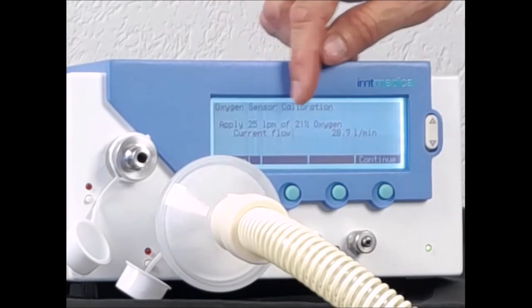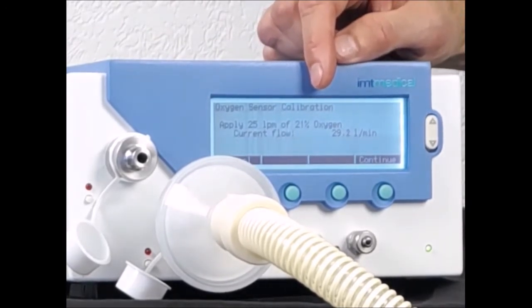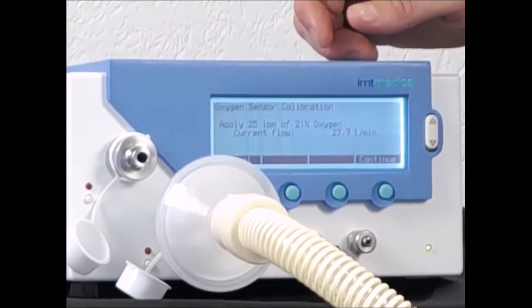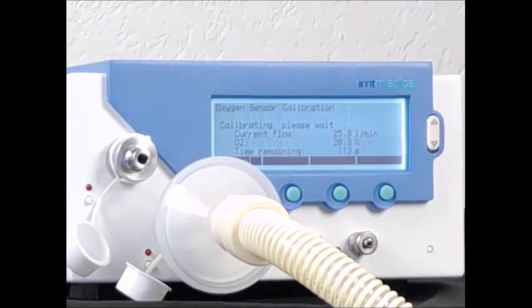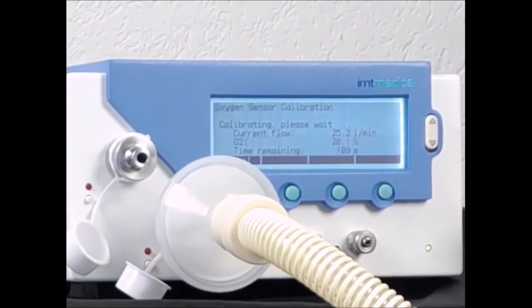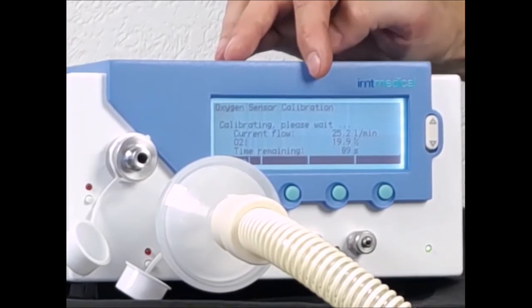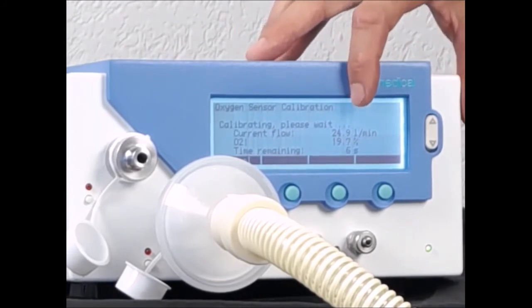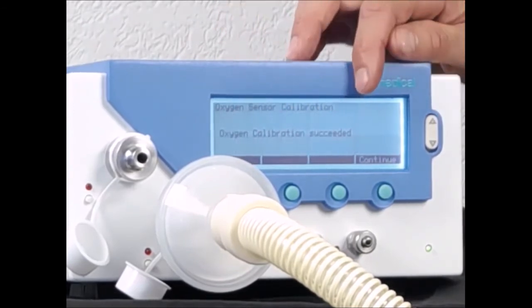It now tells me to apply 25 liters per minute of air. I use the service controller of my ventilator to blow air through — I have 29 liters, so I fine-tune that to about 25. When I am happy, I start the 21% point of oxygen calibration. This process, which takes two minutes, is only required once a week or ahead of very important oxygen measurements. Our oxygen calibration is right about to be finished — 8, 7, 6 seconds to go. That completes the 21% oxygen point, and our oxygen sensor calibration has been successful.